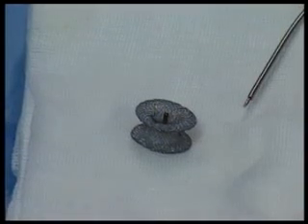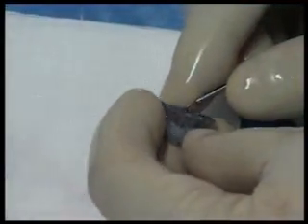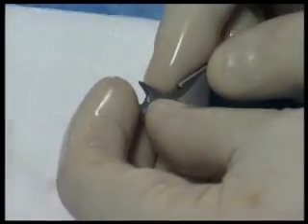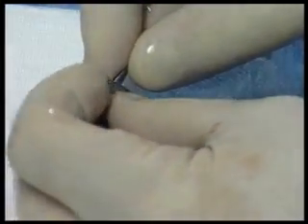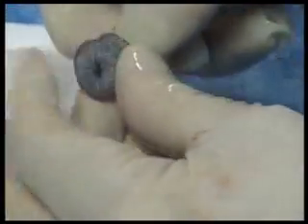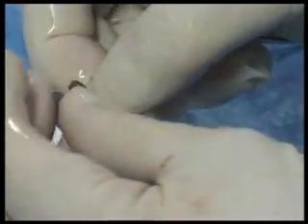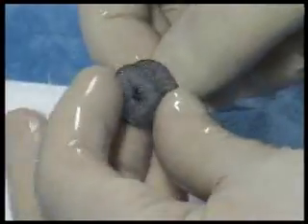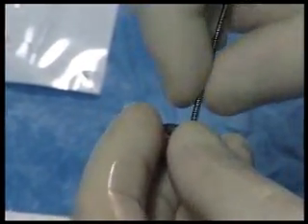The waist is smaller, and since the membranous septum has a much shorter septal thickness, I would like to use a shorter waist device. A muscular VSD occluder's LV disc may impinge a little bit on the aortic valve, even though the echo demonstrates some separation. But in engineering terms, what is the radial force of the perimembranous 10 millimeter device versus the 10 millimeter muscular device? It should be higher, and possibly the chances of eroding the conduction system are higher. But the stent length between the two discs is shorter.